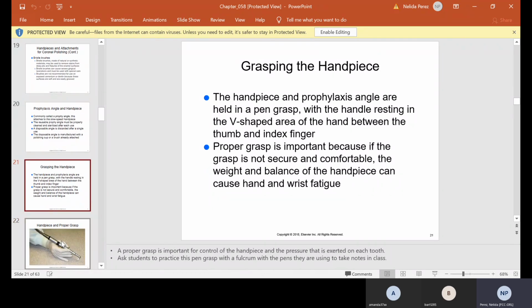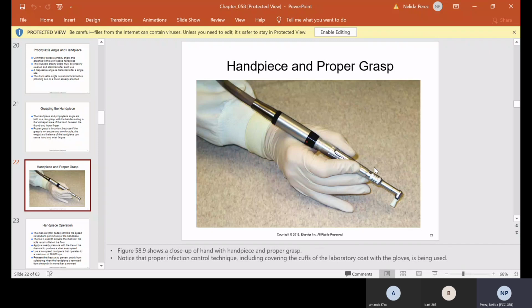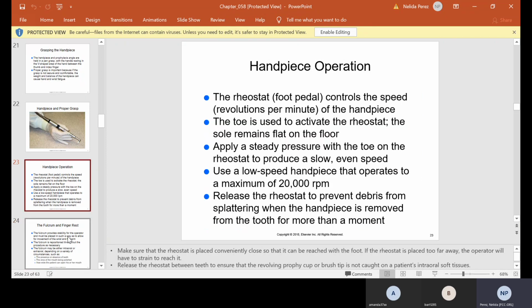The handpiece and prophylaxis angle are held in a pen grasp with the handle resting in the V-shape area of the hand between the thumb and index finger. Proper grasp is important because if the grasp is not secure and comfortable, the weight and balance of the handpiece can cause hand and wrist fatigue. So this is the proper way to hold. So pen grasp, like if you're holding a pen with your thumb and index finger, and then you'll probably use your ring or your pinky finger as a fulcrum, a stabilizer.